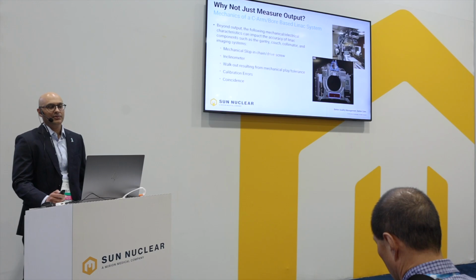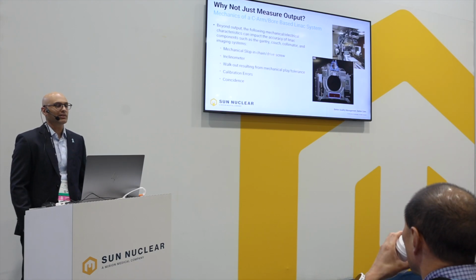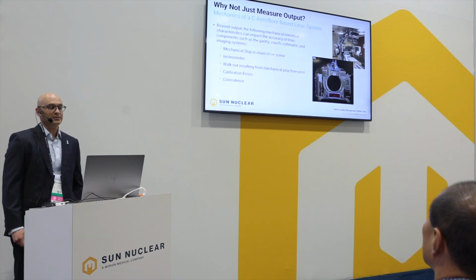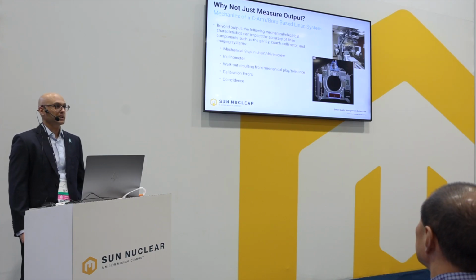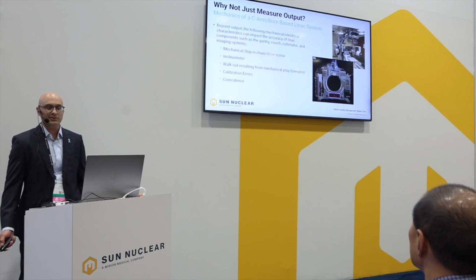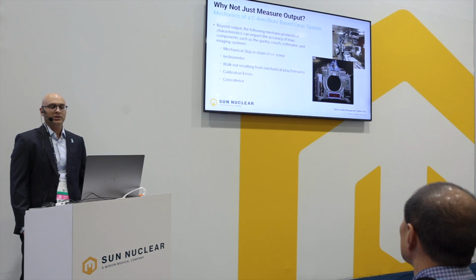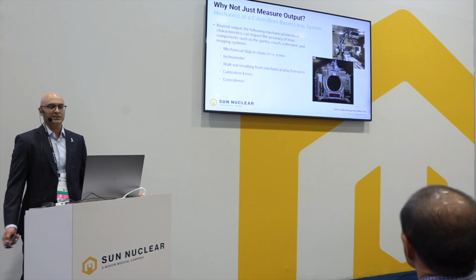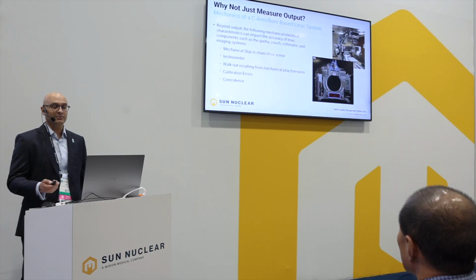Well, the thing is, if you look at any traditional C-arm or bore-based linac system, you do have a lot of moving parts. It's pretty complex. You could have mechanical slop in the chain, the drive screw, you could have loose inclinometers, walkout from gantry rotation, whether from installation tolerance or just wear and tear over time. And this all results in an error between your RT and your imaging isocenter, which of course leads to inaccuracies in your beam delivery. So as a user, I would want to know this every day.